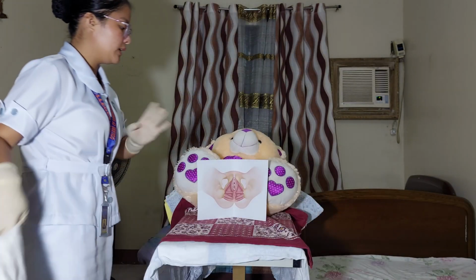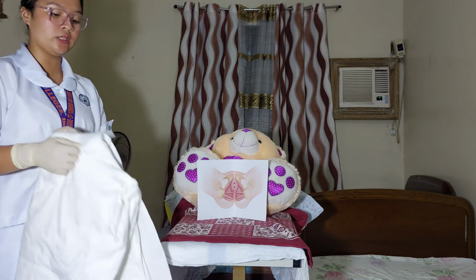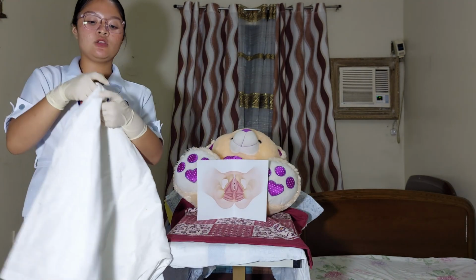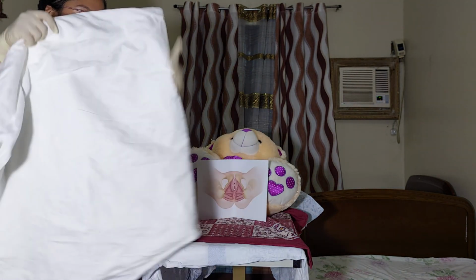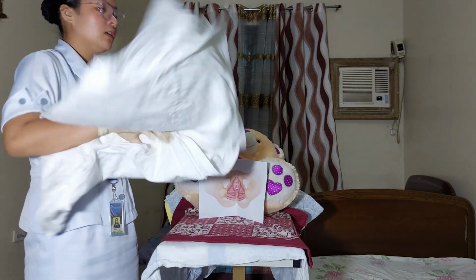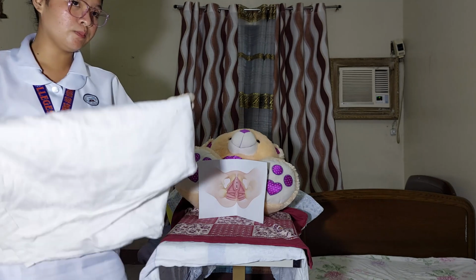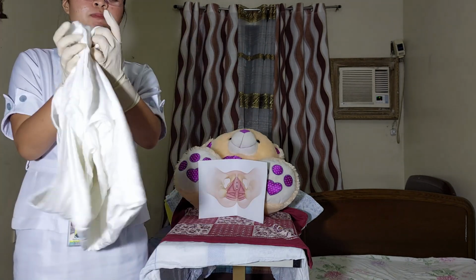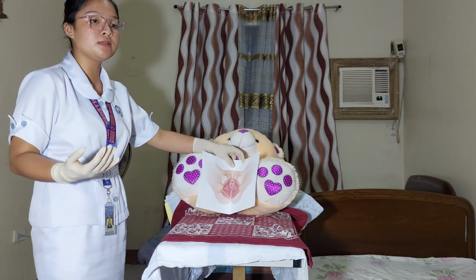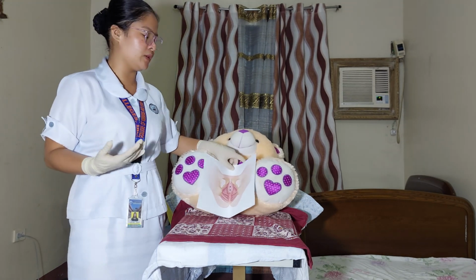So, dahil mahirap i-drape yung patient ko ngayon kasi hindi naman siya totoong tao, let's say na lang na naka-drape siya. So, para mag-drape is kailangan naka-diagonal siya. Since mahirap nang gamitin yung drape ngayon, basta ang purpose ng drape is magbigay ng privacy sa patient at hindi ma-expose yung mga private part ng patient. Yung mga body parts ng patient na hindi naman kailangan na-examine.